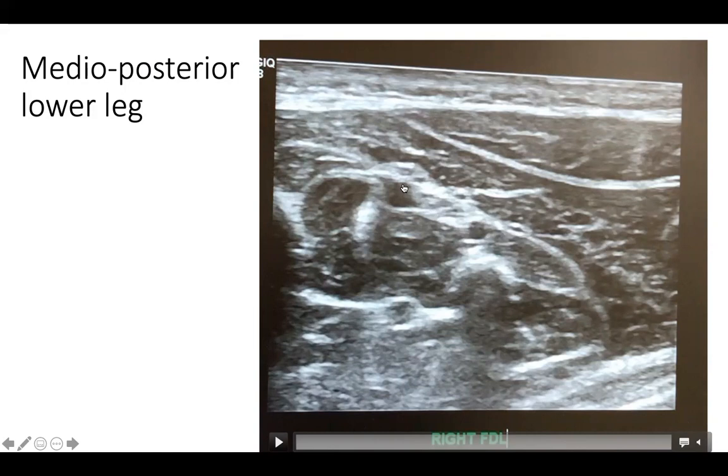tibial nerve. So between this triangle, flexor digitorum longus, and flexor hallucis longus, above the fibula, right? So your home base is tibia and fibula. This is the square bathtub muscle, looks like a bathtub. This is the posterior tibialis, central tendon. And then this is the posterior tibial artery, fibular artery, tibial nerve. And this is the anterior tibial artery and anterior tibialis. Let's take a look.